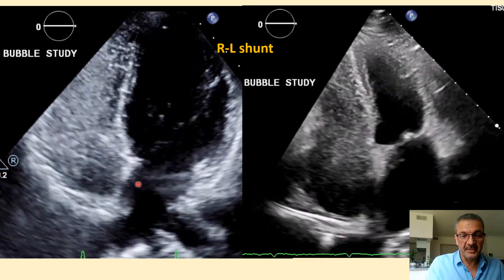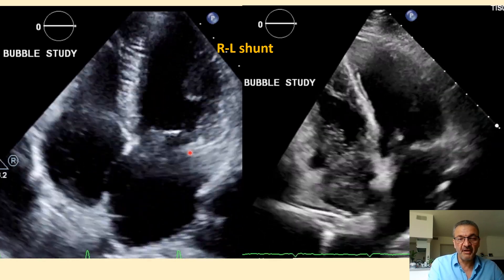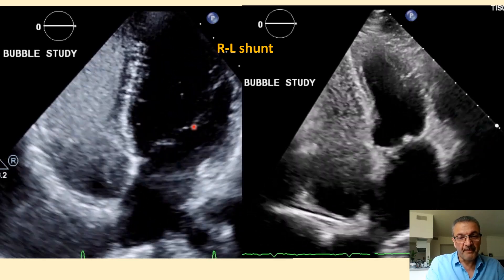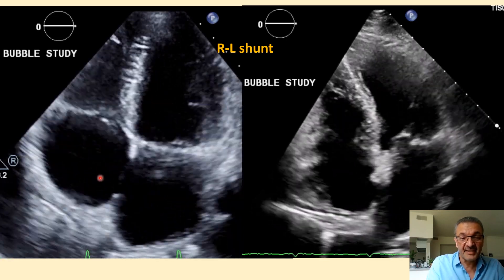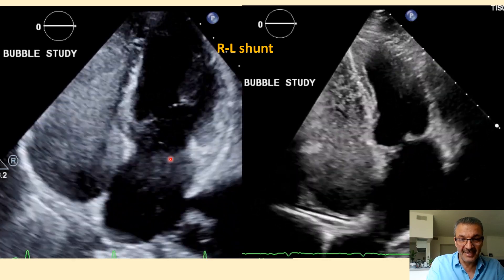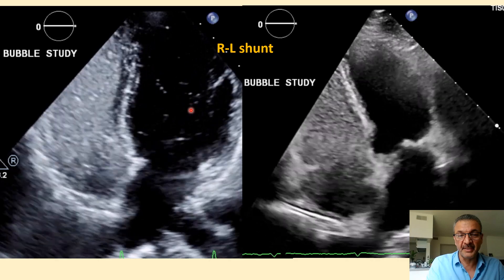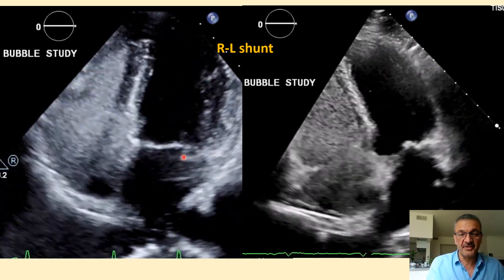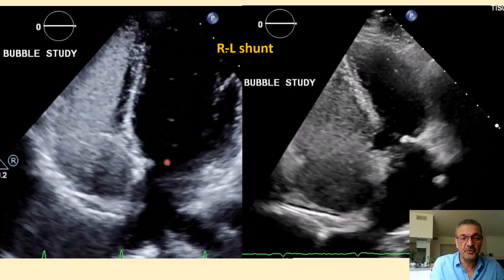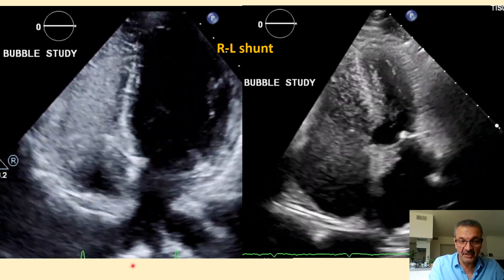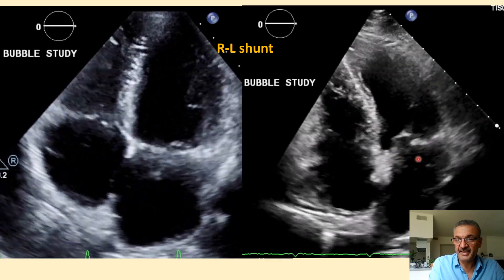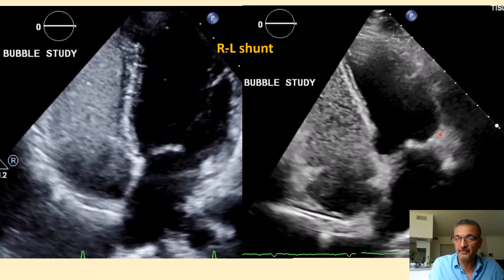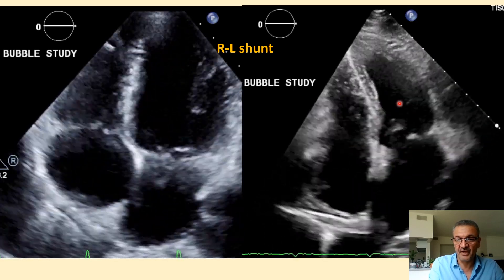Another important point: not only the origin of the bubble coming to the left side matters — the timing of appearance is important too. If there is a right-to-left shunt, bubbles show up usually less than three beats after bubbles appear in the right side. If it shows bubbles on the left side within less than three beats, it is positive. Between three to five beats after appearance of the bubble on the right side, if it shows up in the left side, it is suspicious. You must confirm those bubbles come from the interatrial septum, not from the pulmonary route. In this case, the same patient, you can see many bubbles after almost two beats showing up in the left side, in the left ventricle.